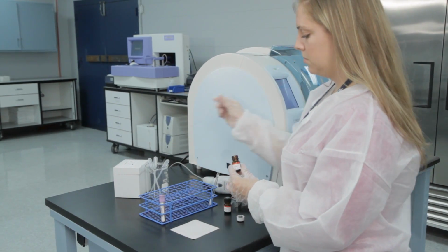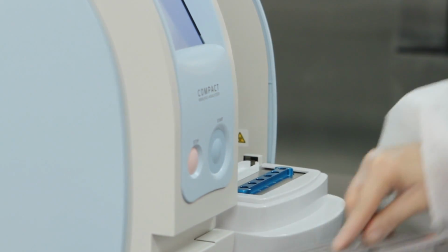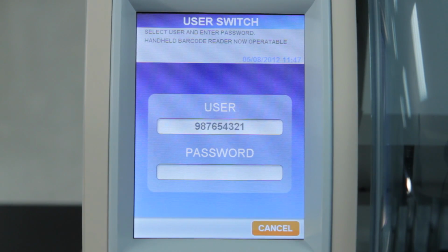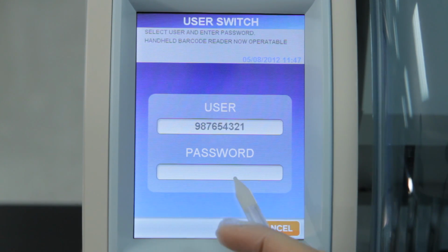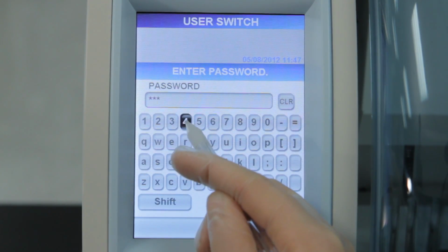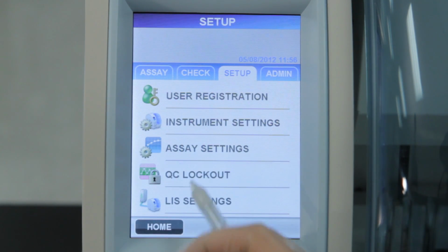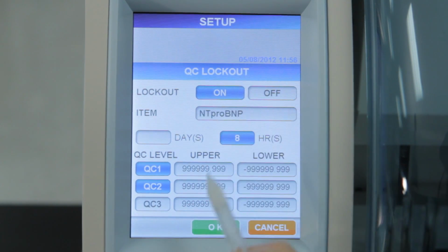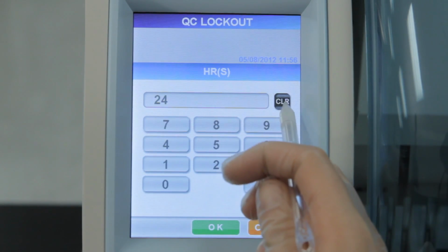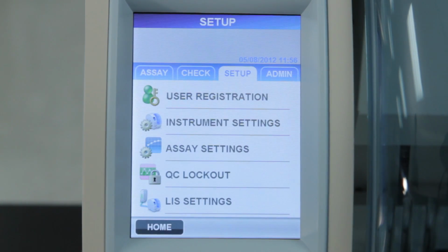External quality controls should be run each day of use according to your local standard operating procedure or as directed by your accreditation agency. The PATHFAST offers a combination of security features. User ID and password features give you the peace of mind that unauthorized users cannot operate the system. The settings are user-defined. The PATHFAST also provides a lockout feature for calibration, QC, and cartridge expiration. The PATHFAST will not allow testing due to quality control expiration, quality control failure, infrequent calibration, or reagent expiration.